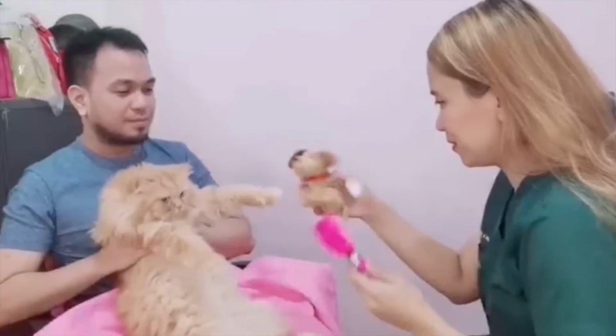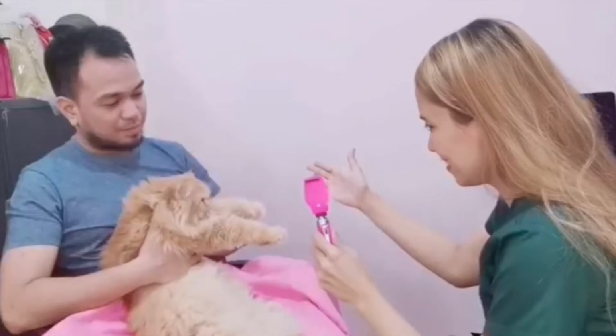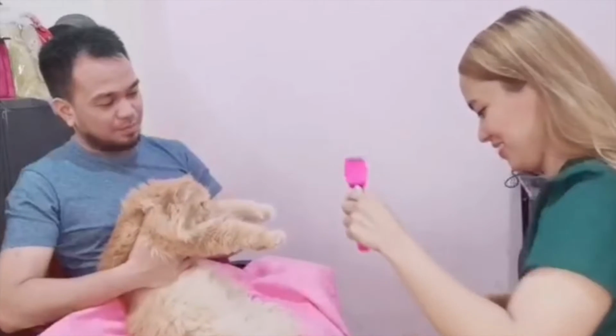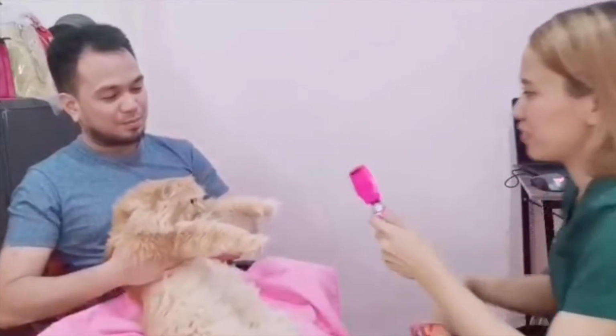You will start by explaining to the parent that you are going to examine the child's eyes. Then ask the child to focus on a distant point. You may use an eye-catching object to make the child focus on a distant point. You can also tell the child that the ophthalmoscope is not harmful, so that the child will not be afraid and will be cooperative in the examination.